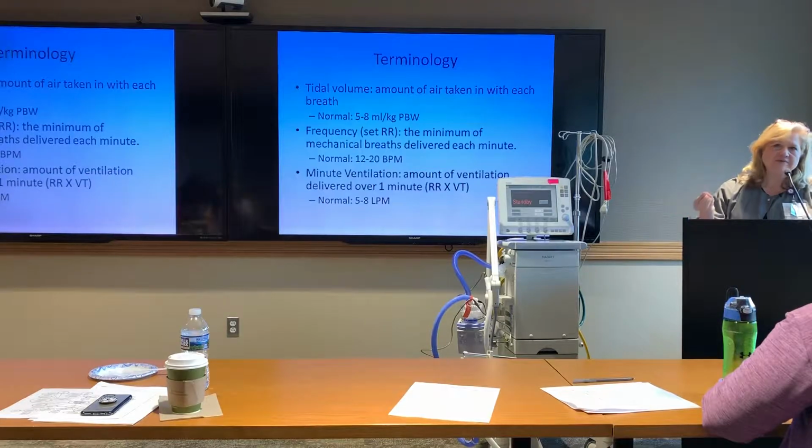Why? Because if I have a CO2 that is 40, which is perfectly normal, and I'm breathing 6 liters per minute, that's great. But if I have a CO2 that's 40 and my minute ventilation is 20, I got serious troubles there. And that is taking me 5 times the amount of normal ventilation to maintain normal CO2. So there's a lot of physiologic issues there. It's important to know how fast that car is going to generate that PO2 or CO2.